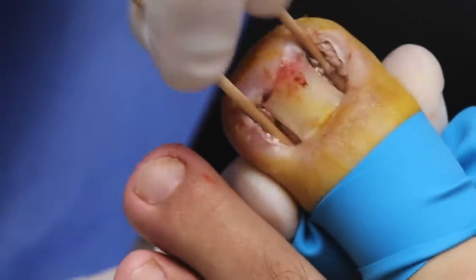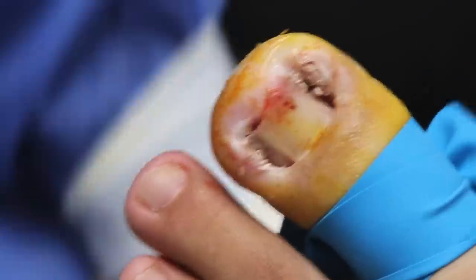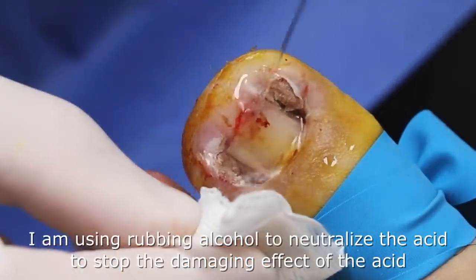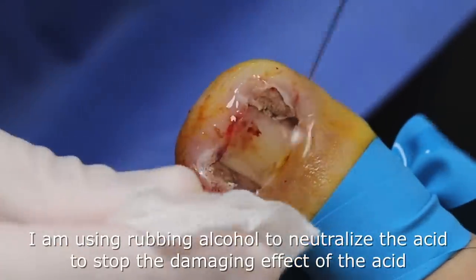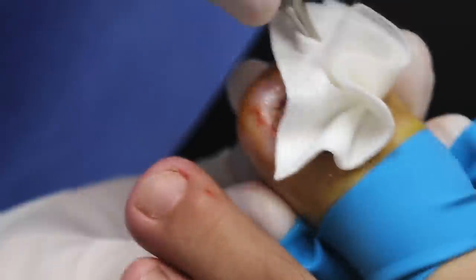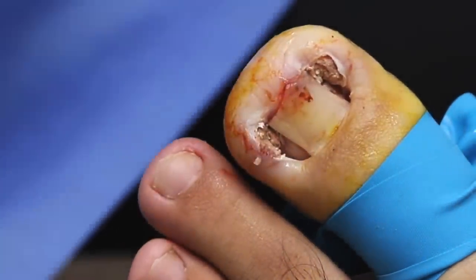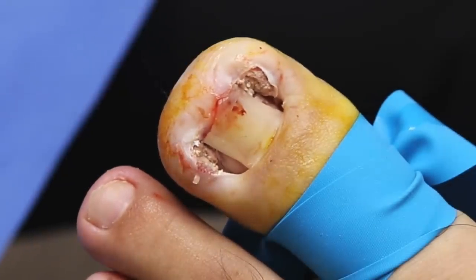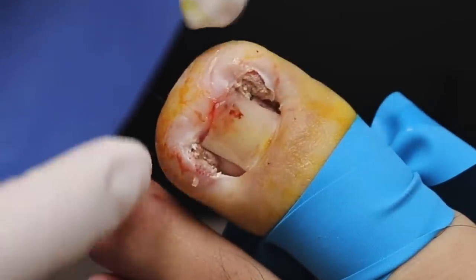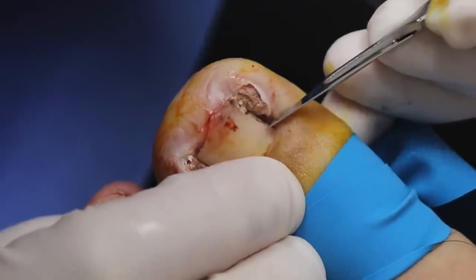I'm really making sure we kill the sides so we don't get any more problems. That's all done. So now removing the ingrown is finished. And now we're gonna do the skin. Let me dry this area up. So this is what's really gonna help you reduce the shape of the toe. If not, it might close up a little bit but it's still gonna have this ball at the top. This is the scary part but again, shouldn't feel anything.